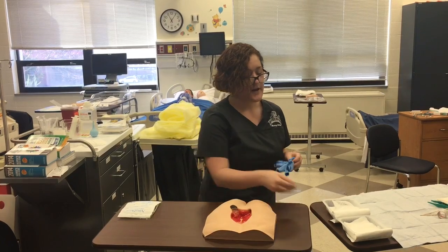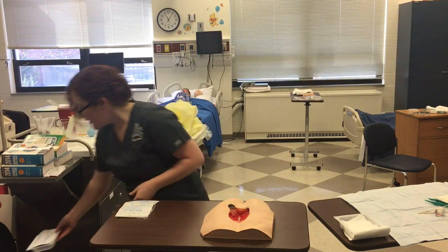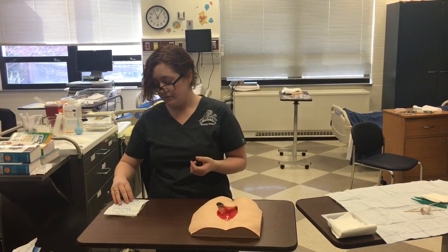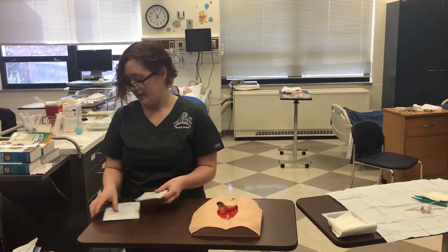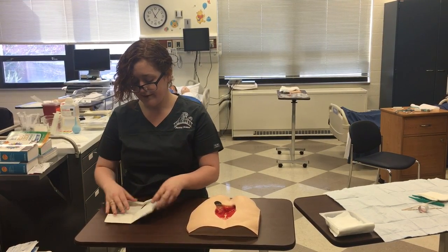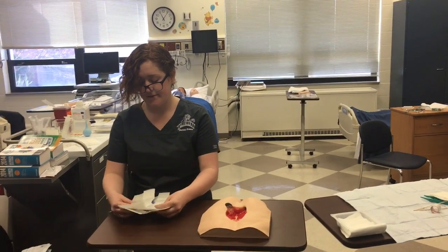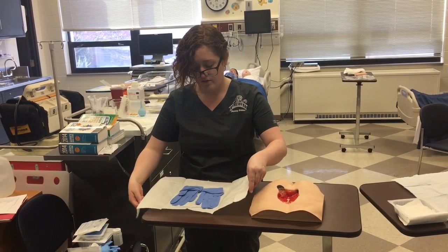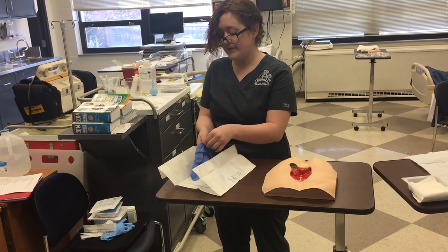Remove my gloves, and I am also going to take the gauze that I have used and dispose of it so that I do not get it confused with my sterile gauze. I'm going to perform hand hygiene once again, and now I'm ready for my sterile gloves. Okay. I'm going to open them so the letters are facing me. And the inside of this is considered sterile, so I want to make sure that I'm not touching the inside of it. I'm going to glove my dominant hand first, so I'm going to grab the non-sterile folded side.